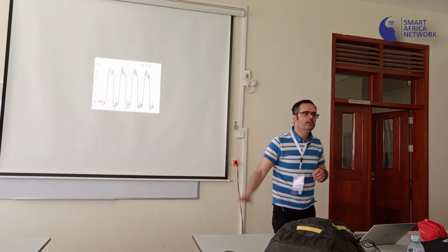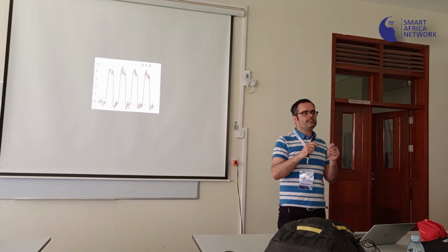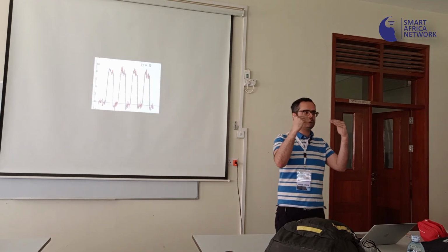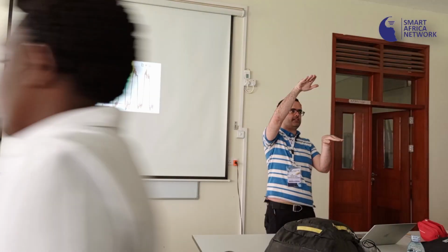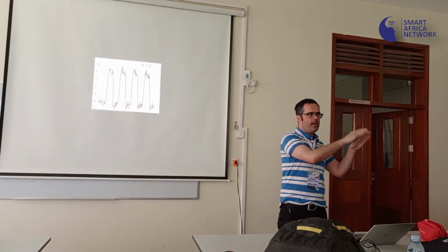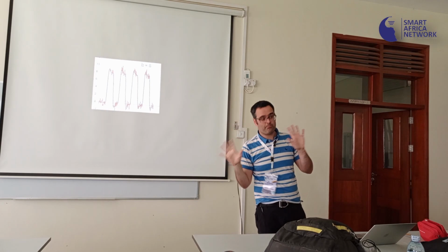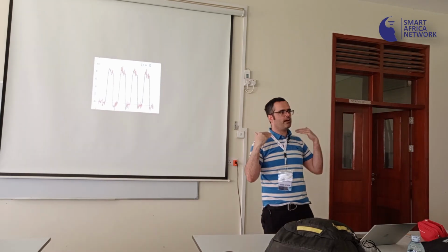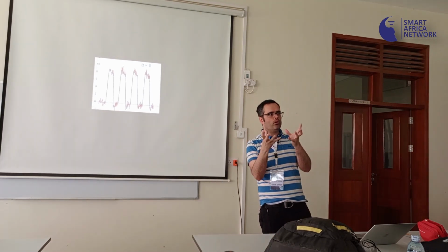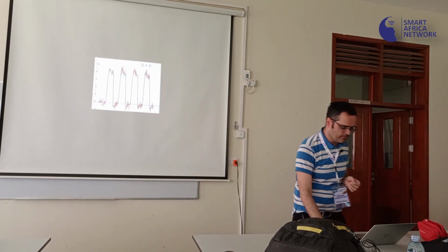And then ultimately we can run a linear model across all the voxels in your brain, all the regions that we scan, and then we can see which parts of your brain fit best. Where does the blood flow stay low for 30 seconds, and then go high for 30 seconds, low and high, and we can match this pattern as we scan brains rapidly every 1.6 seconds. So that's the other part here, is that we can scan the entire brain, so that we can look across the entire brain and see where the blood flow goes and where it follows the pattern of the task that we're trying to do.